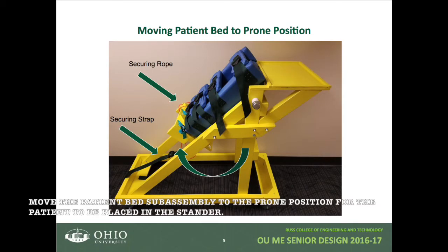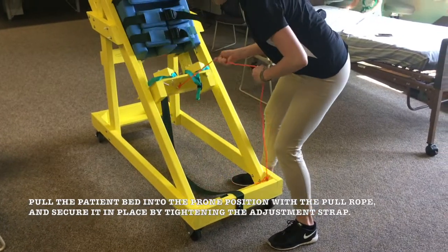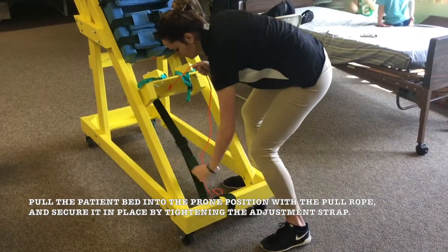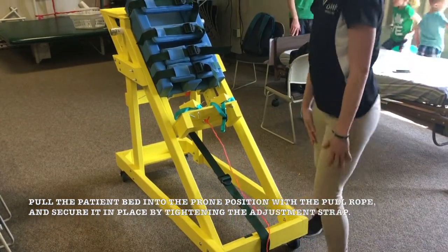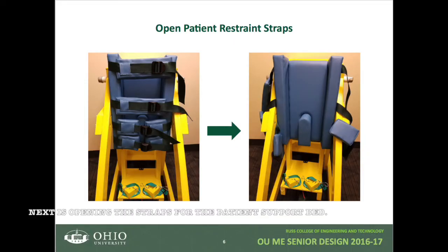We are now ready to move the patient bed subassembly to the prone position for the patient to be placed in the stander. Pull the patient bed into the prone position with the pull rope and secure it in place by tightening the adjustment strap.